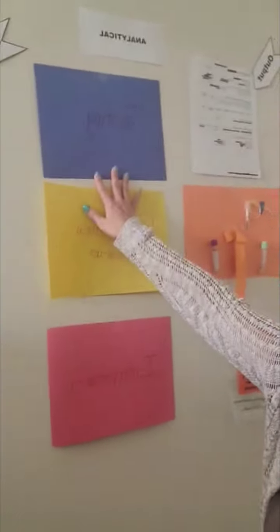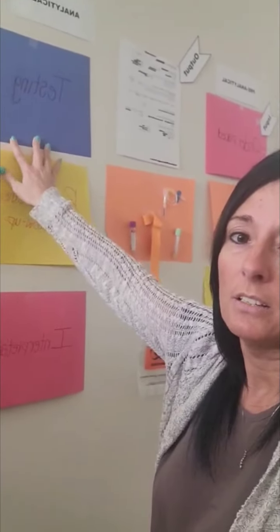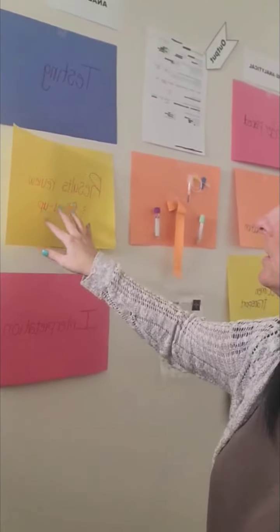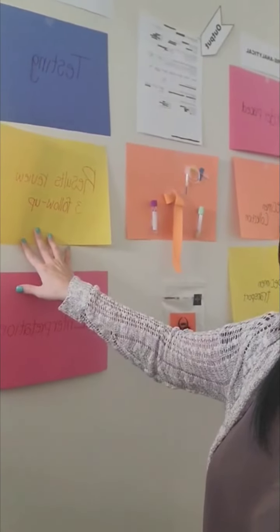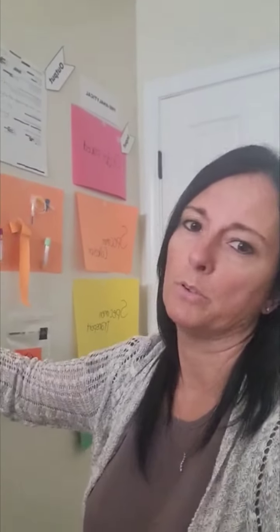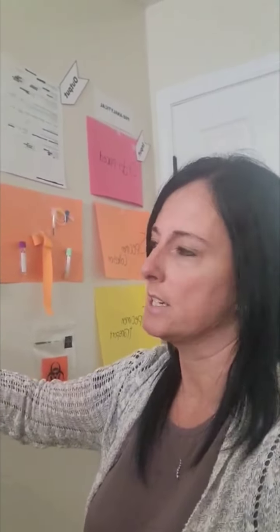Okay, that was our pre-analytical phase of testing, and next we're going to go with the analytical phase of testing. So after centrifugation, the CMP is run. In our office, we use the Cobas Roche Pure, which is the C303. Okay, after the testing is done, the results are reviewed, and then it'll be decided by the provider what needs to be the next step for that patient.